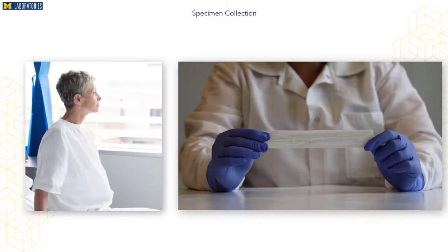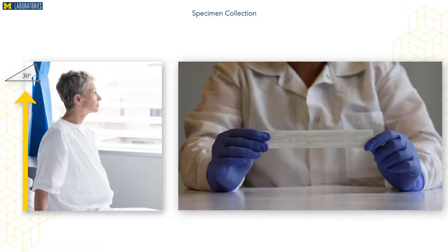After donning the appropriate PPE and explaining the collection procedure, have the patient blow their nose to clear any secretions, because secretions could make it difficult to collect the epithelial cells. Begin by positioning the patient for comfort and to facilitate safe specimen collection. The patient can be placed into a sitting position or can lay down with the head tilted at about 30 degrees to open the airway. Check the patient's nasal pathway to ensure there are no obstructions, such as a deviated septum.